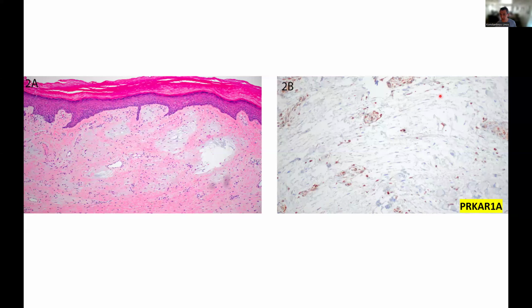The acrofibromyxoma has a striking periungual location, which is uncommon in superficial angiomyxoma, and is more cellular. Also, superficial angiomyxoma can be seen in genital sites, where the principal diagnostic consideration would be deep aggressive angiomyxoma. The immunohistochemical pattern is not specific; sometimes it can express CD34, sometimes not. But because of the molecular pathogenesis of Carney complex-associated and sporadic superficial angiomyxoma, we know they show loss of PRKAR1A immunohistochemistry. And in this case you have a nice internal positive control.